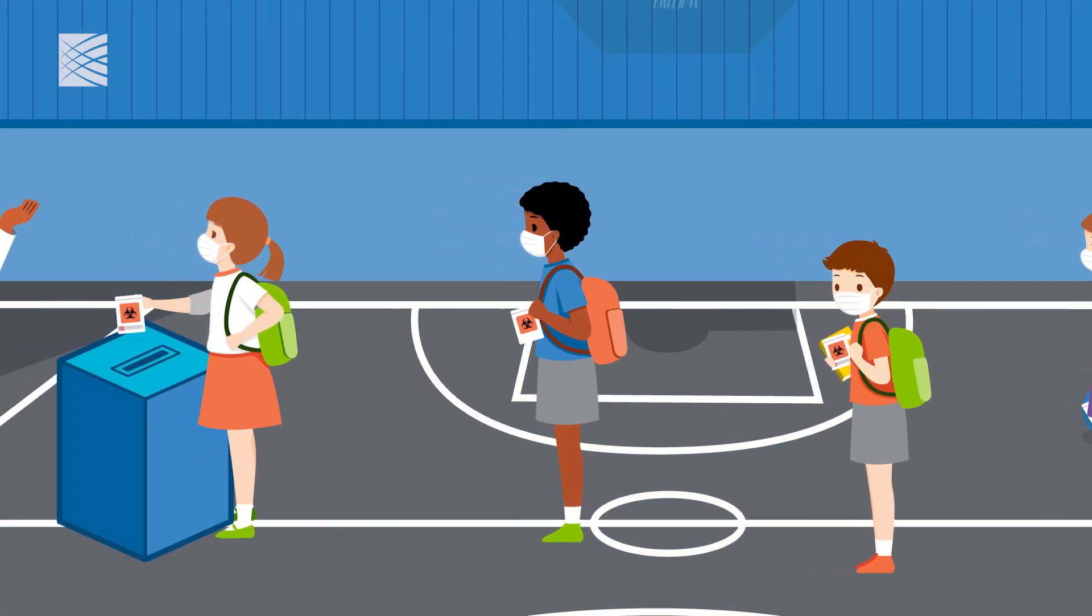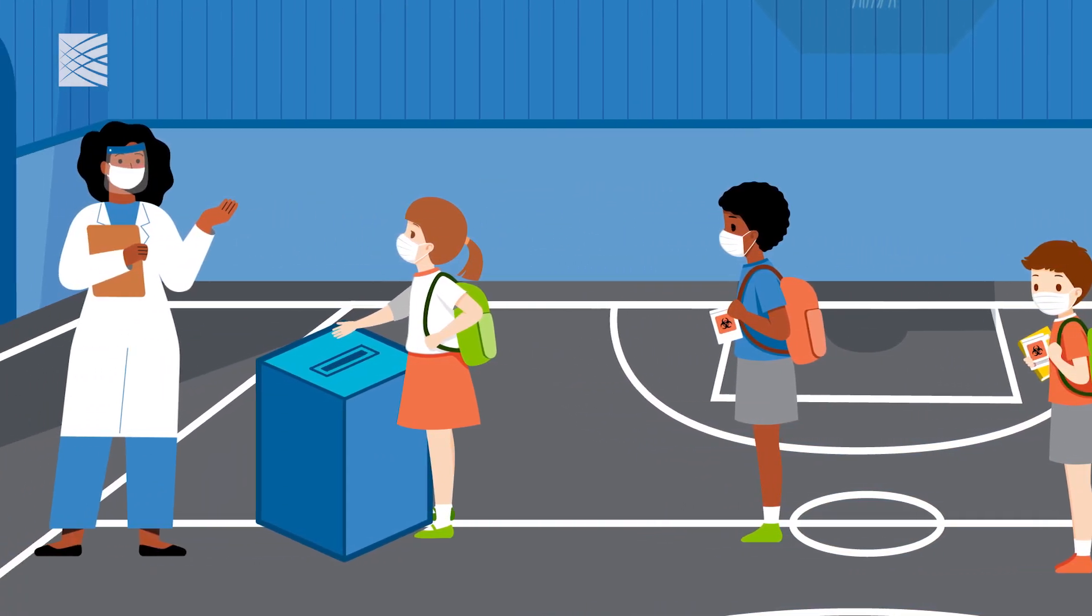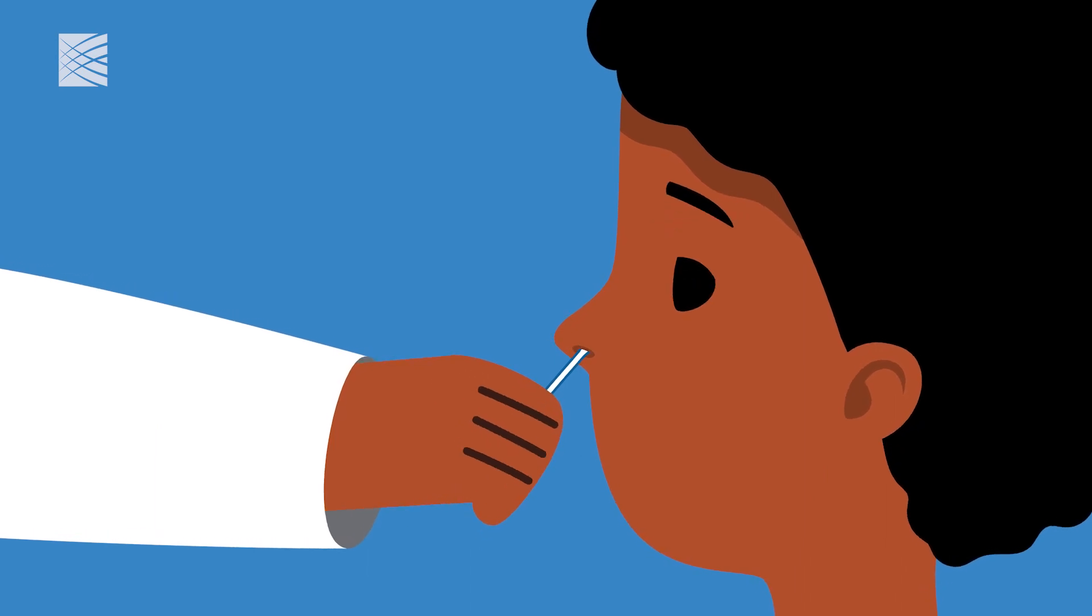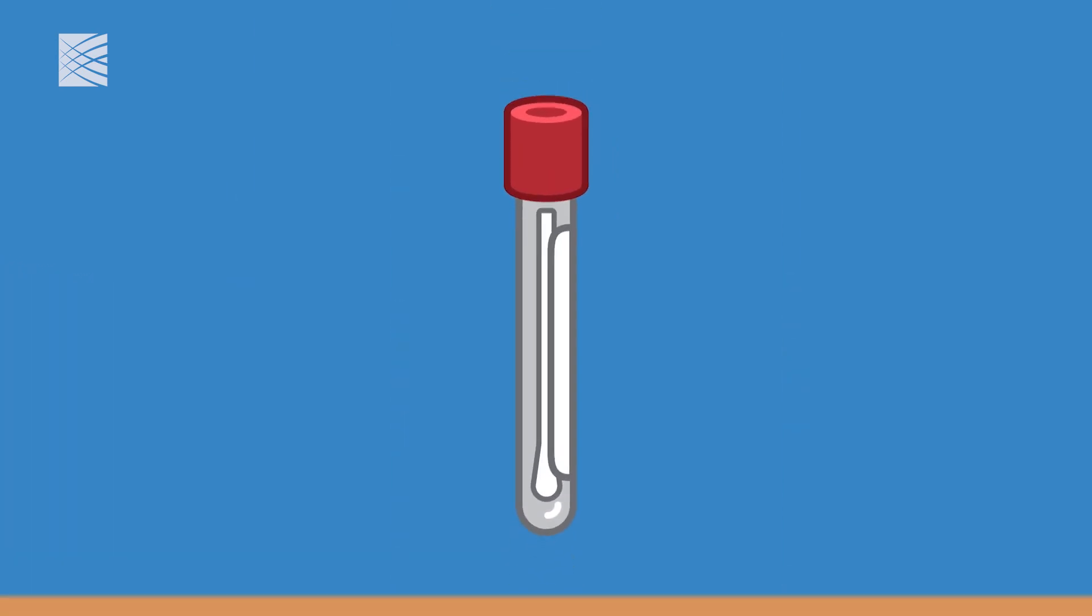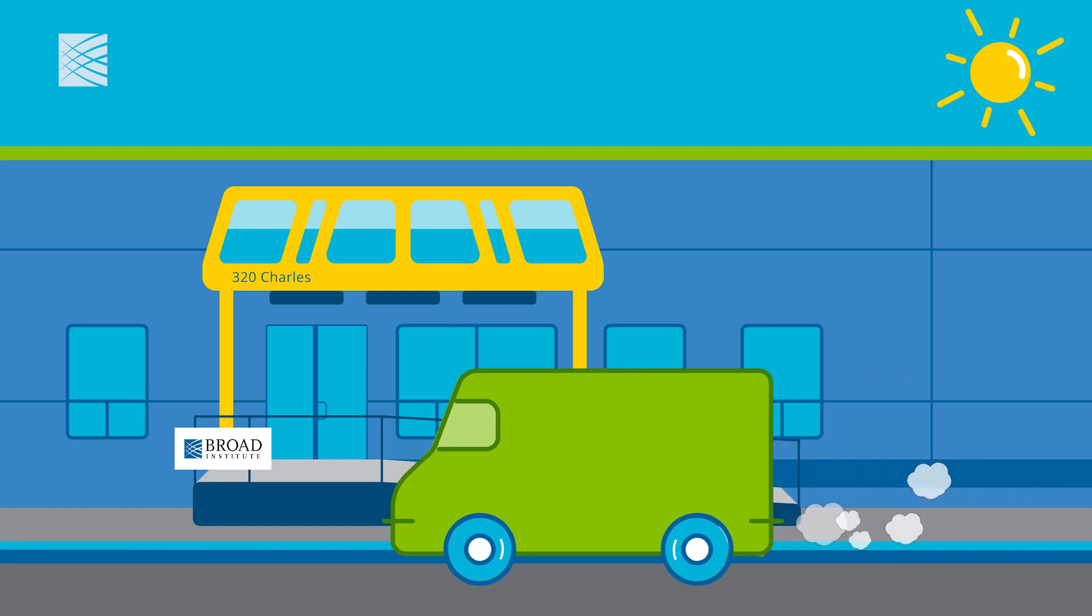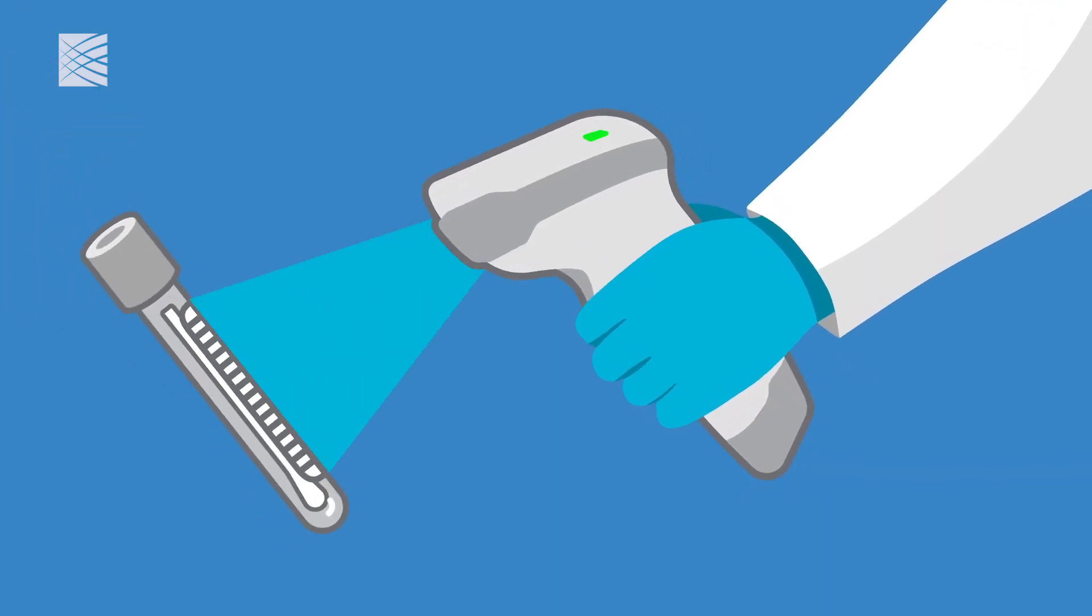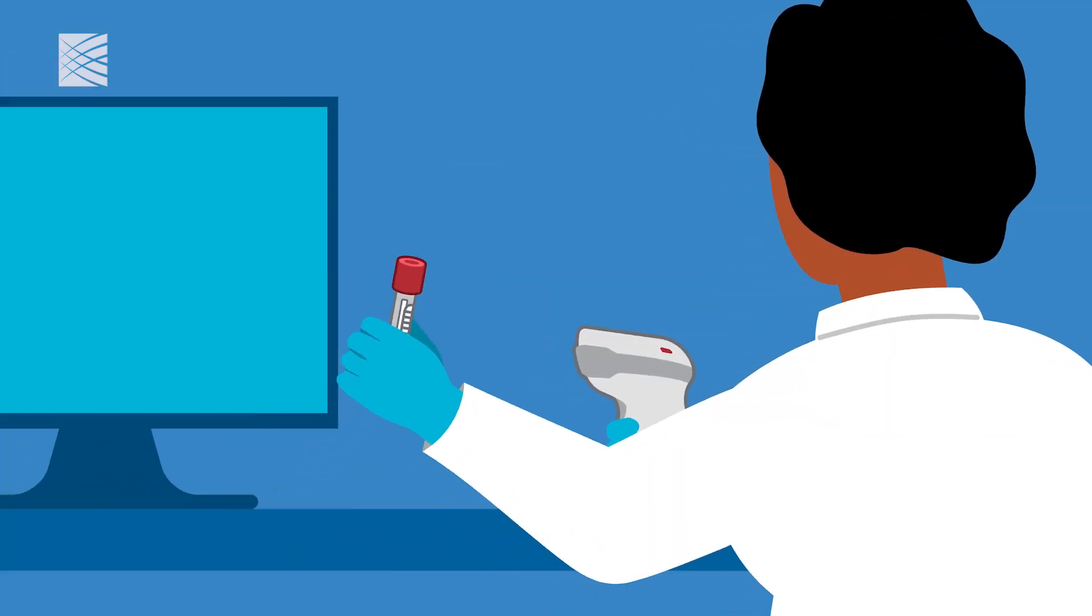Let's take a look at how a sample is processed from start to finish. Once a patient sample is collected, it is packaged and shipped to the Broad. When samples arrive, technicians scan the barcodes on the sample tubes and confirm patient information.